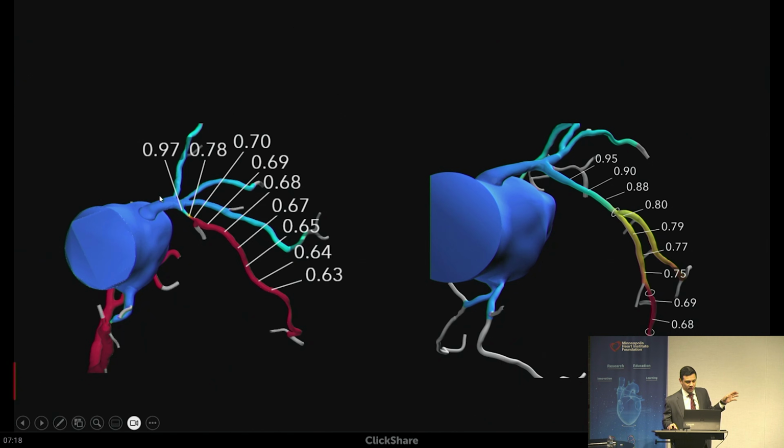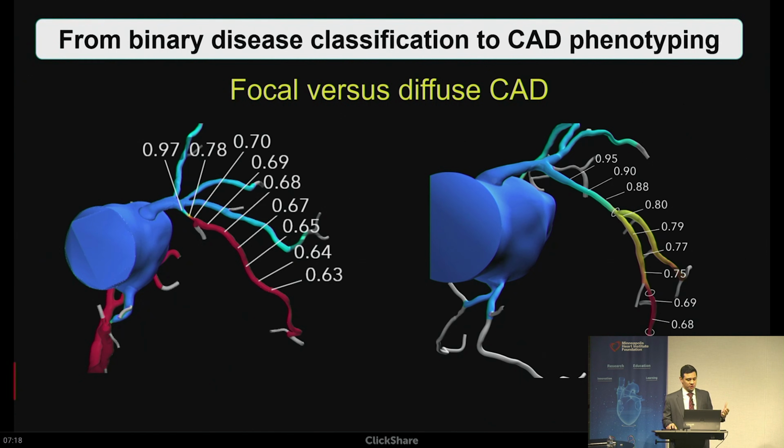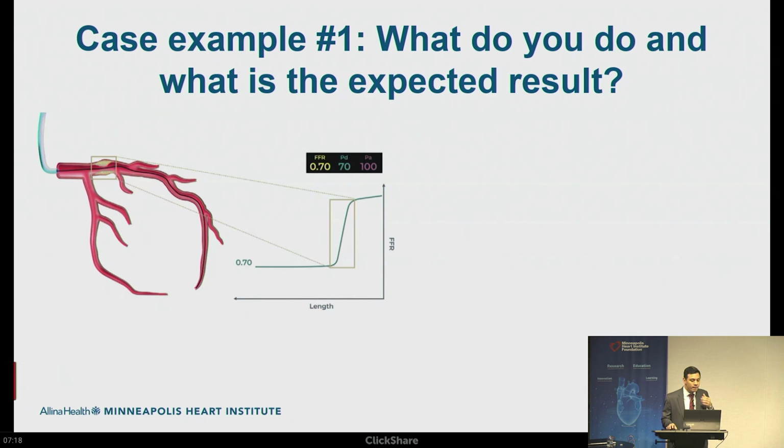The disease on the left, it's a PCI with a stent from here to here that gives you a great result as an operator, and for the patient, symptoms, quality of life. These patients require a little bit of a beta blocker, nitrates, and aspirin and prevention. But they all get treated the same. This appears obvious, but we haven't been doing this in our trials. We haven't been doing this often even in clinical practice. So again, this is a concept that is increasingly being recognized.